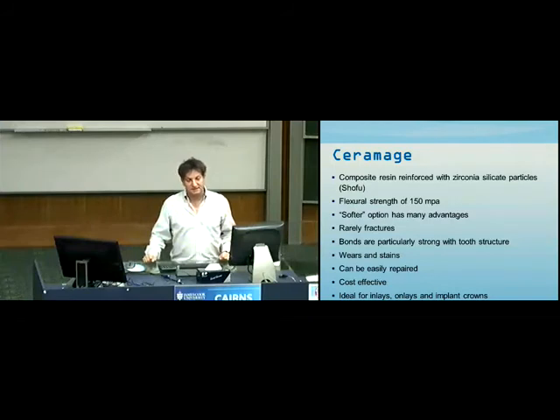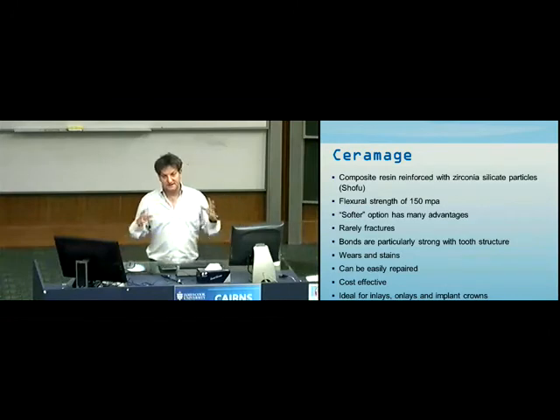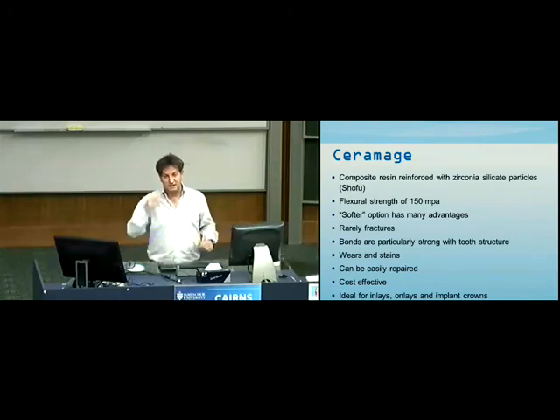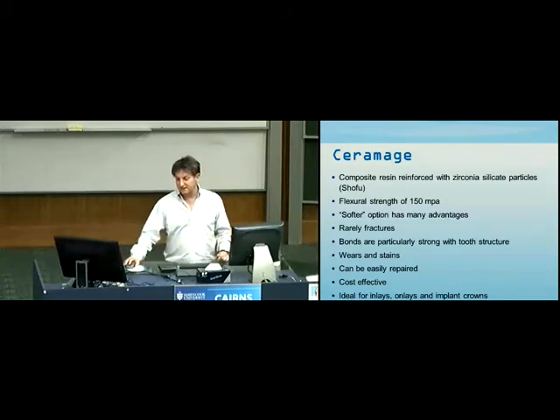Ceramage or Lava Ultimate. I'm not going to go ceramic. I'm not going to go full gold. I'm going to be going a soft material. There's the nutcracker effect. I mean, there are all sorts of interesting discussions about that, but I am going to go soft. I'm sort of convinced that then I'm not going to break my upper right six. So this is something which is near and dear to me.